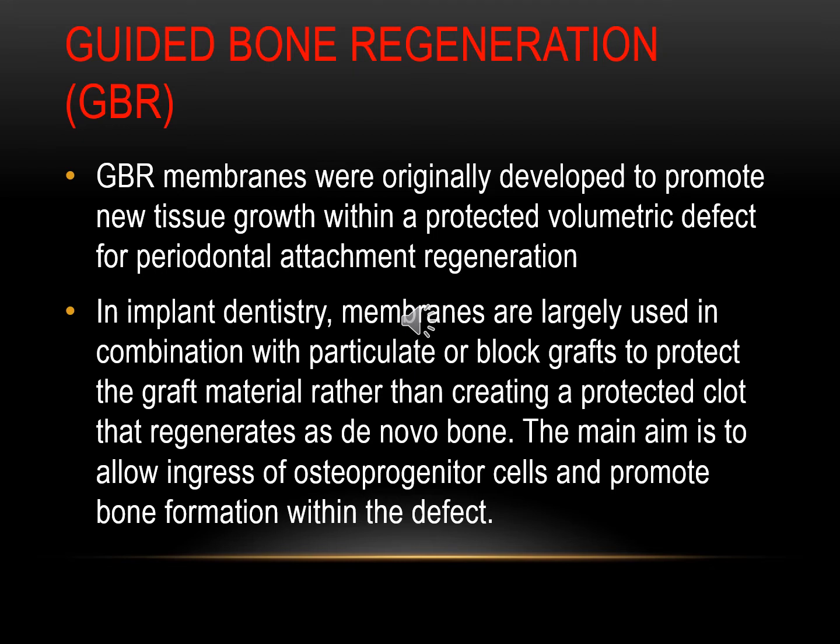It will prevent complete bone formation inside the bony defect, and the result will be osteofibroformation. That means the defect will be filled by bone mixed with fibrous tissue. This is not what we need from the graft and what we need from the grafting procedure.